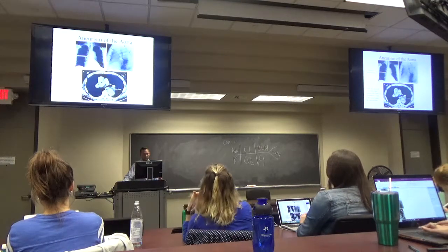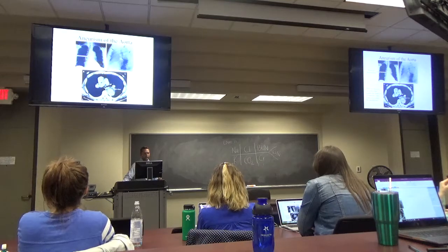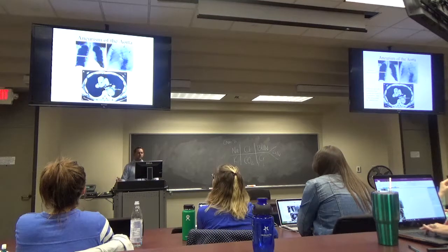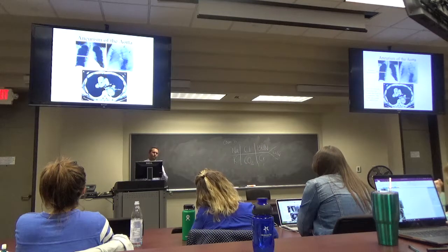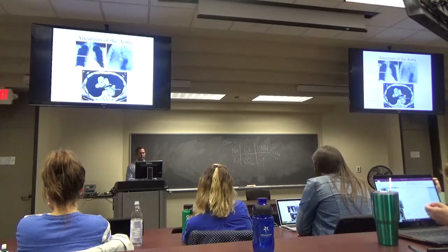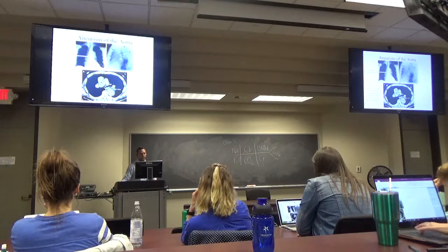This right here shows you a flap within the descending thoracic aorta, and then you have a lumen. I think this is a true lumen in this picture, but over here there's also a structure called a false lumen when you have a dissection. The vessel wall basically opens up, and you have an entrance of blood into there, and that is called a false lumen. Sometimes you can mistake the false lumen for the true lumen if you don't trace back the dissection flap. So I think that's what that's trying to say right here.